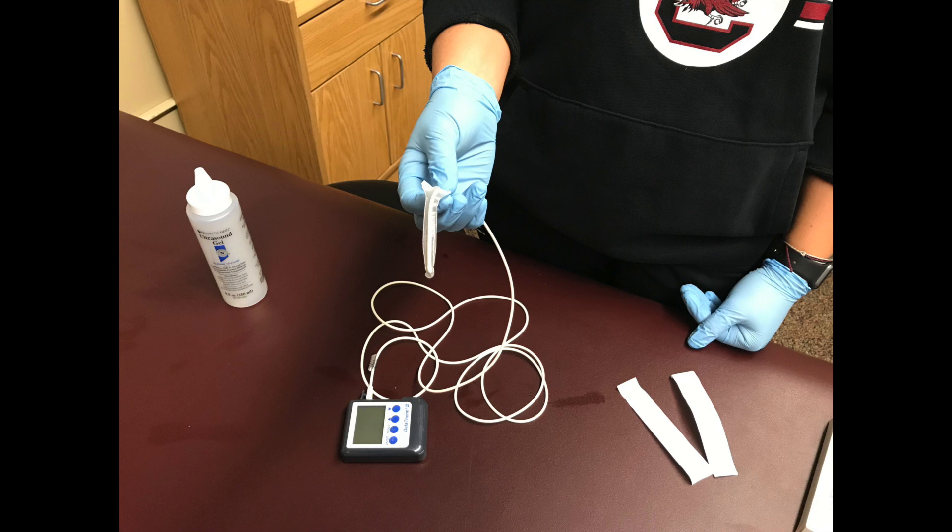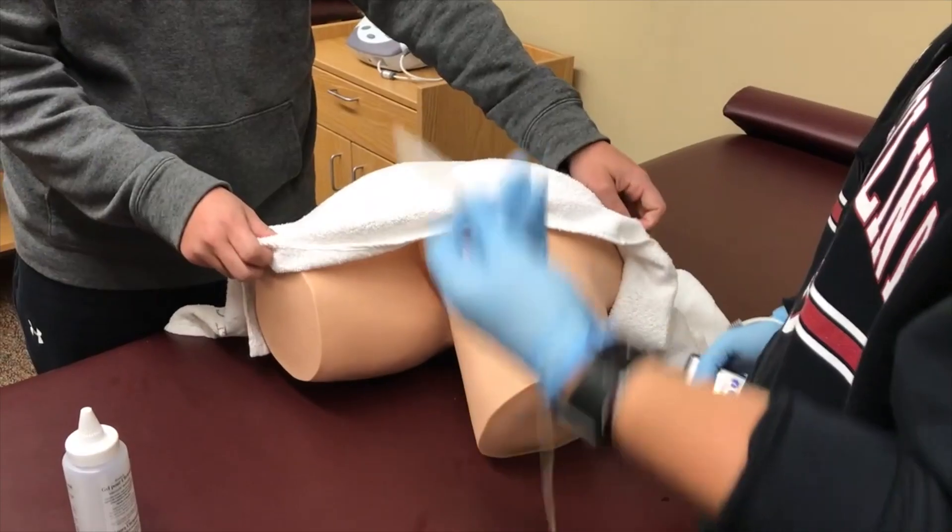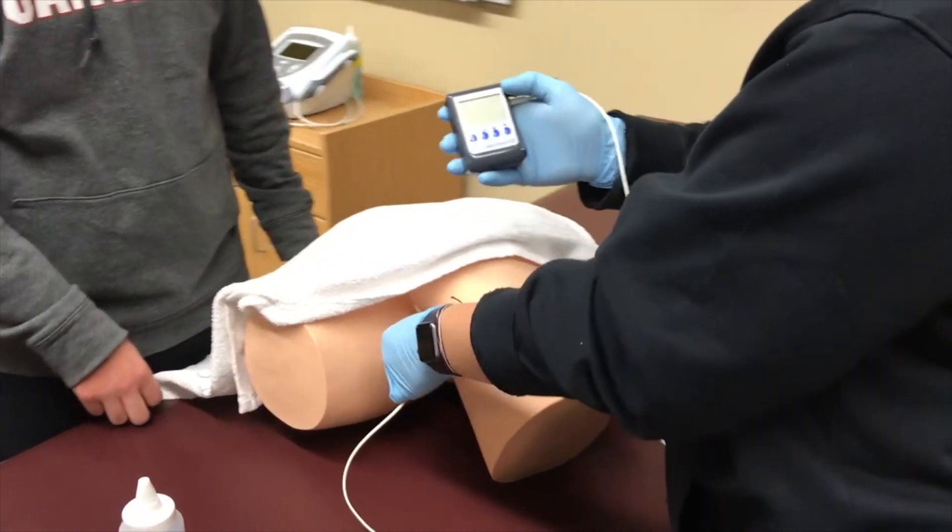This is what the thermometer should look like before inserting into the rectum. The thermometer should be kept in the patient until their temperature drops back down to normal.